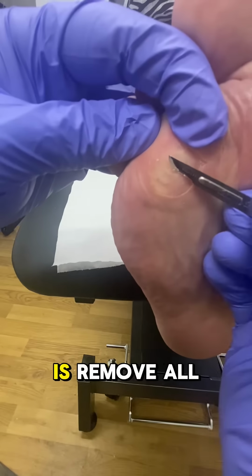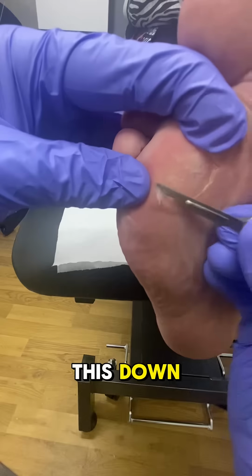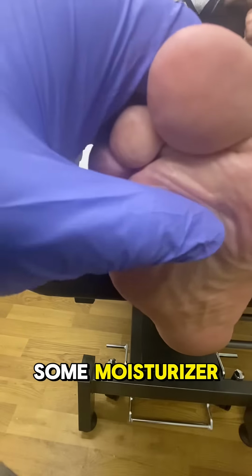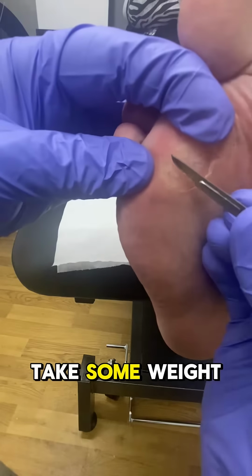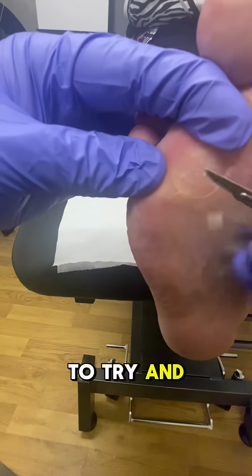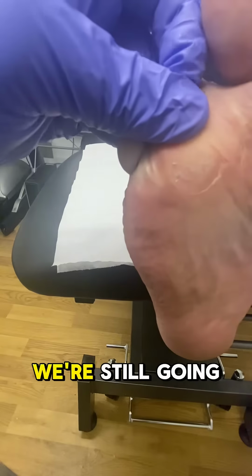So of course what we do is remove all the callus, remove all the painful hard sections, and then smooth this down. We usually do it with the rotary sander, smooth that off, then encourage the patient to use some moisturizer. We also change their footwear, get them wearing an arch support orthotic insole to take some weight in the arches, and we'd probably put a metatarsal dome on that orthotic as well to try and deflect the pressure here. So actually, we're still going on this one.